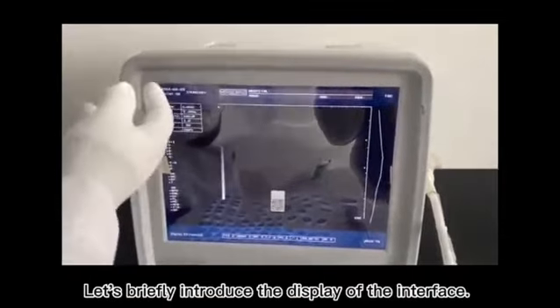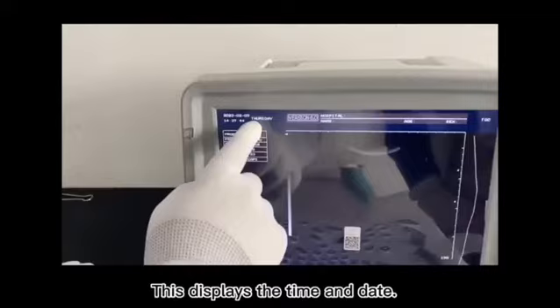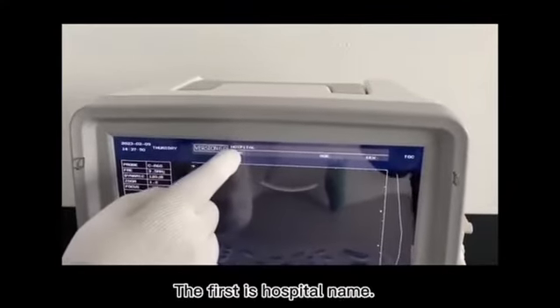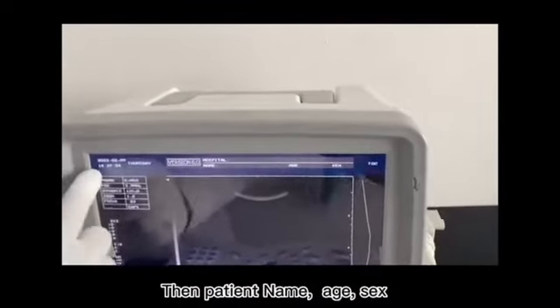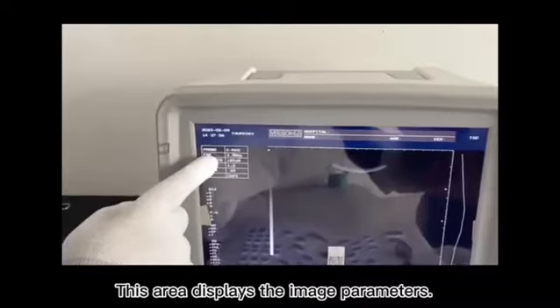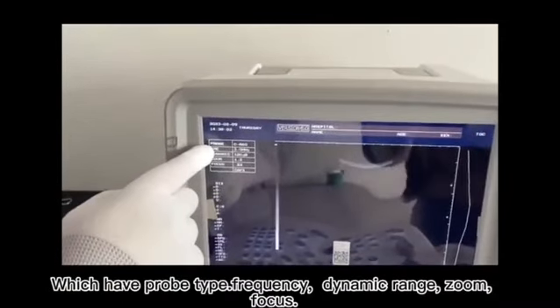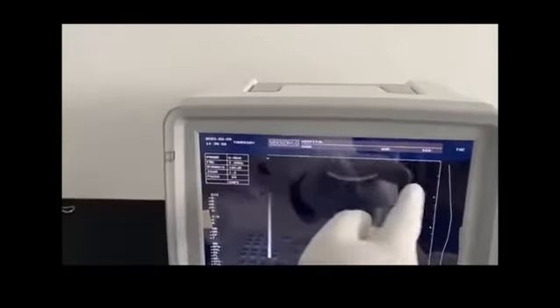Let's briefly introduce the display of the interface. This displays the time and date. This area is the annotation area. The first is hospital name, then patient name, age, sex. This area displays the image parameters, which have probe type, frequency, dynamic range, zoom, focus.